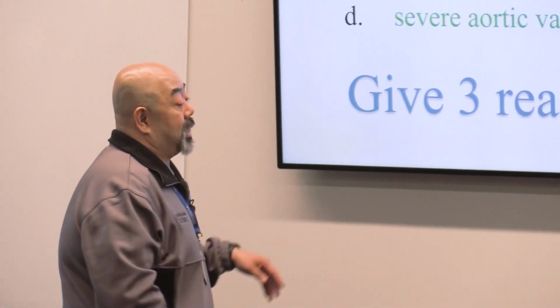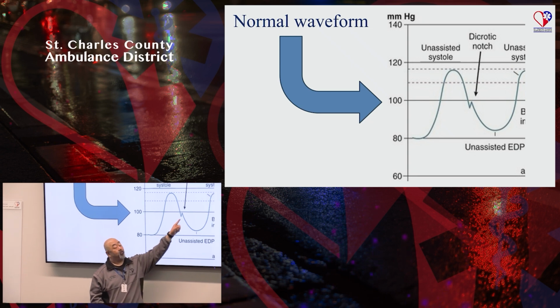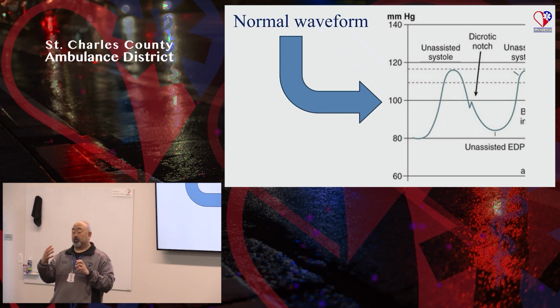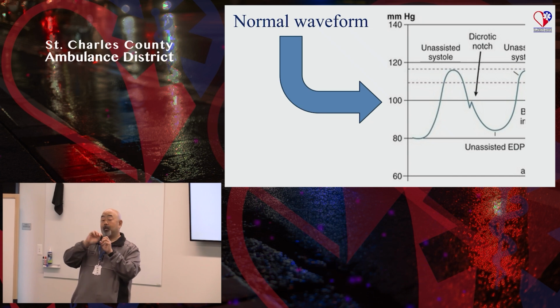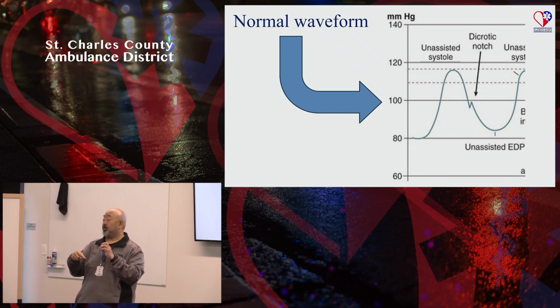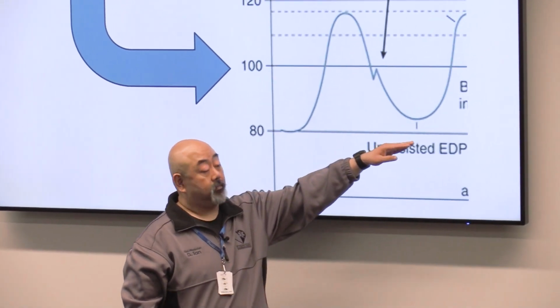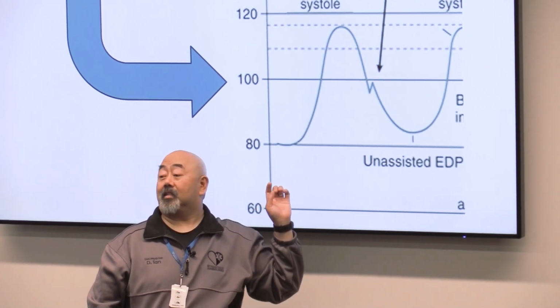Okay, so in the aorta, you're looking for that pressure wave to give you the dicrotic notch, which is right here, which theoretically is because when that aortic valve slams shut in diastole, that back pressure bounce is transmitted down to the transducer for just a millisecond, so you see that little dicrotic notch. So somebody tell me what we're looking at here. There's kind of a hint here. This is the patient's own unassisted normal waveform.